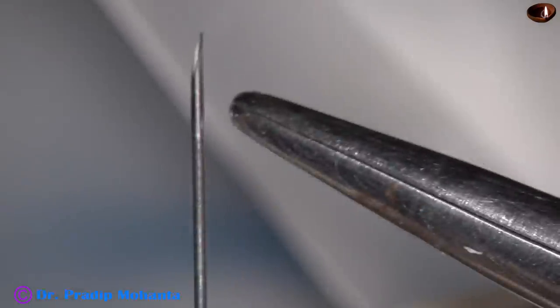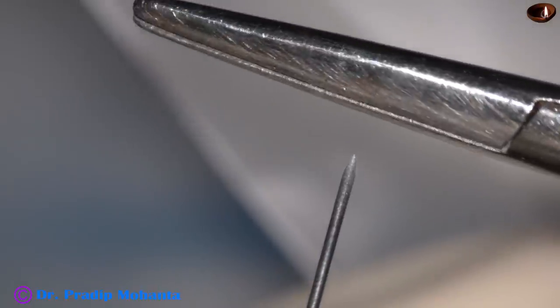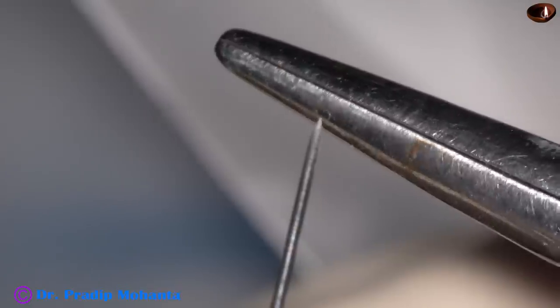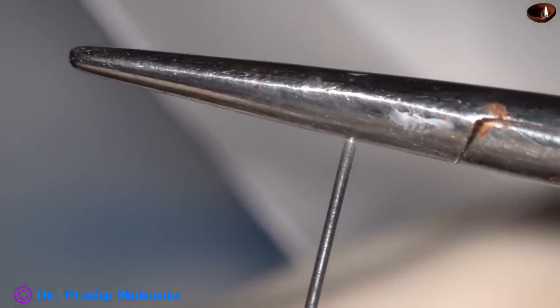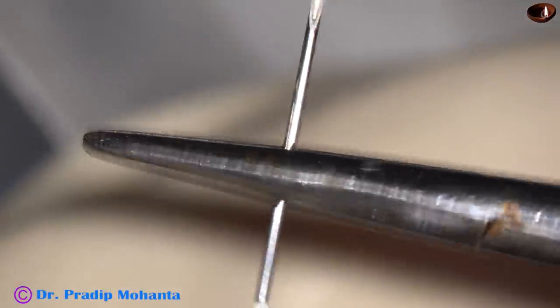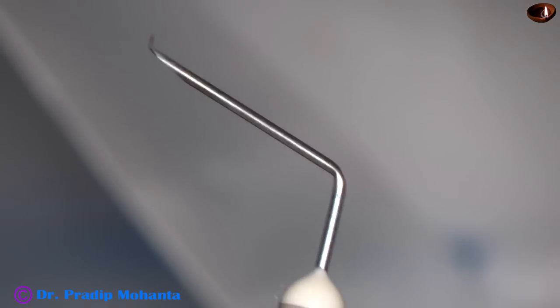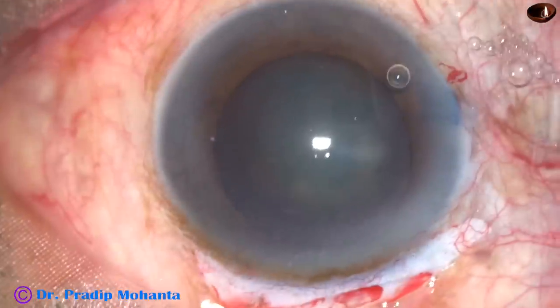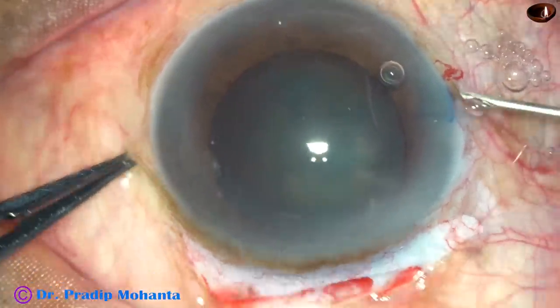Take a 26-gauge needle and a strong needle holder. The bevel is down and, opposite the bevel, we are going to bend it — this bend is not 90 degrees; it is less than 90 degrees, about 70 or 80 degrees. Now make another bend near the half, also less than 90 degrees. Your cystitome is prepared; now use this instrument to do capsulorrhexis.